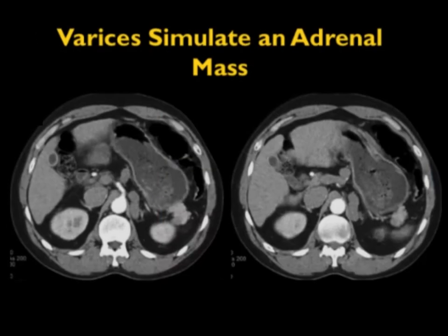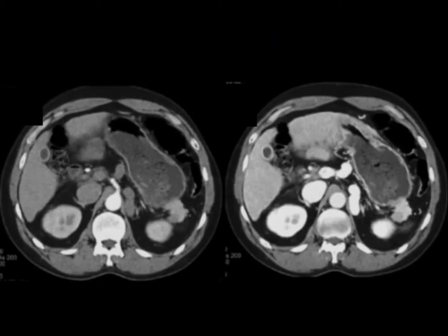This patient was referred for a left adrenal mass. When you look at the images quickly, it looks like a left adrenal mass — you see the normal right adrenal — but notice the patient is in arterial phase and there are textural changes in the liver. This patient has cirrhosis, and when you go from arterial phase to venous phase, you can see that the structure thought to be the adrenal is simply a large varix. It's very important to recognize that varices can simulate adrenal masses.